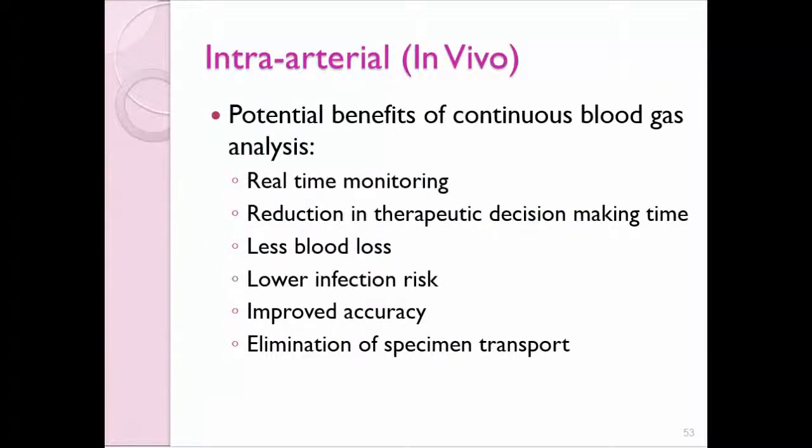And now intra-arterial monitoring. Potential benefits of, well, I guess this is actually analysis since it's invasive, but what goes on here with this intra-arterial reading, this continuous reading, is you don't remove any blood. You do place a catheter in the artery, but you don't withdraw any blood. So it provides you real-time monitoring, has a reduction in therapeutic decision making time, so I don't have to wait on my results to get back from the blood gas lab. It reads them out right there on the monitor.